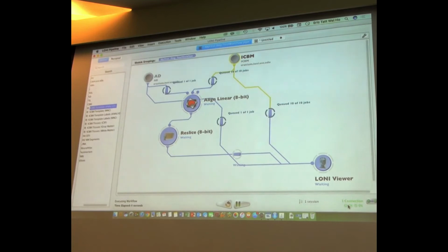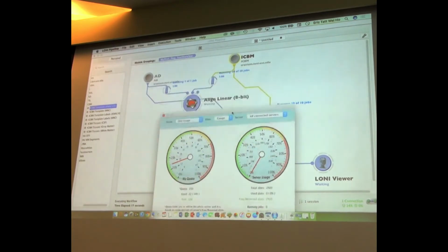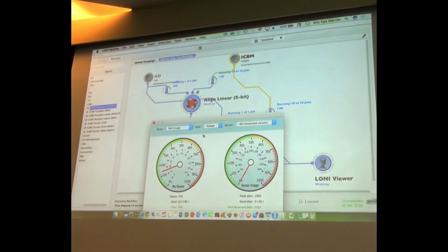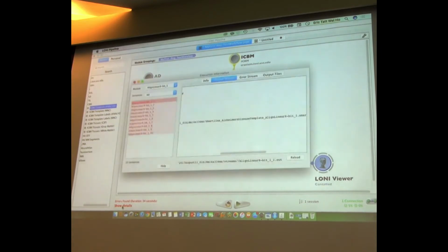So here is our process monitor. We're at 0. We should be now at 10. Boom. 22. Oh yeah, because I have two things running in parallel, right, you guys? I have these guys and these guys together, so let it finish. As jobs finish, you see how you kind of go down, kind of tells you where you are. Oh my goodness, that's going to give me heartburn. What's the problem now?